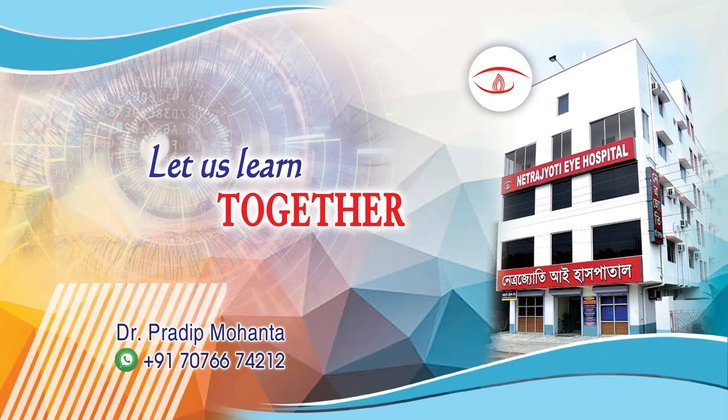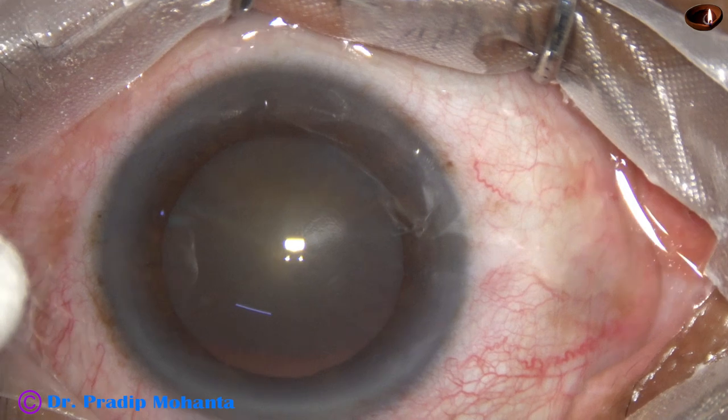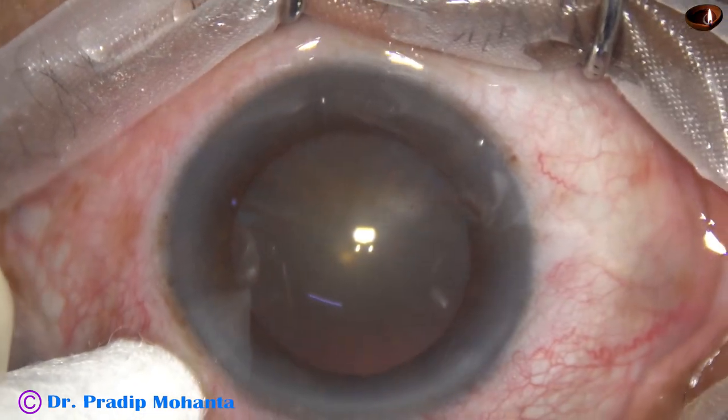Friends, welcome to my workplace for hands-on FECO and SICS training. This is a very soft cataract. Let us see the management of this case. This is a totally unedited recording.